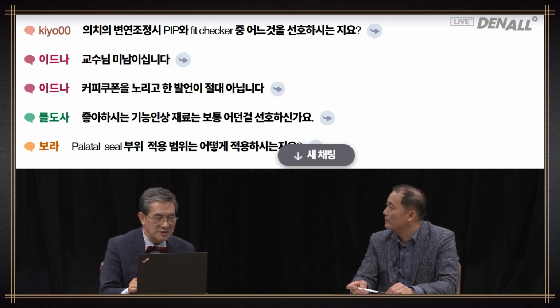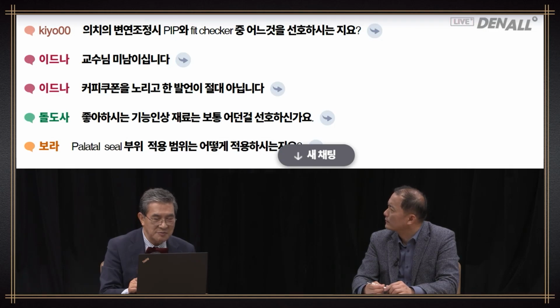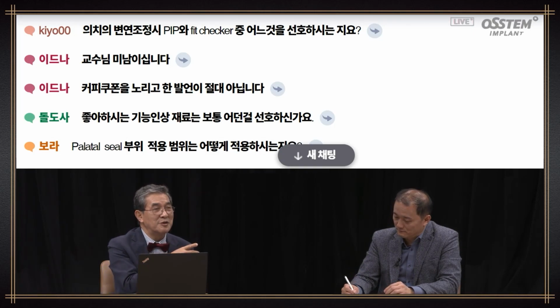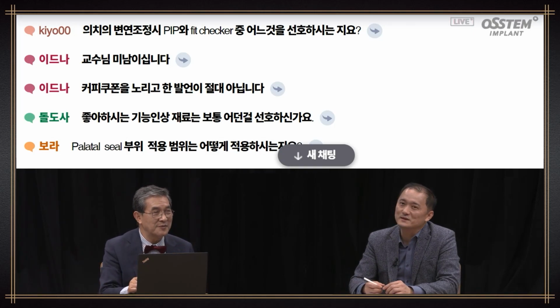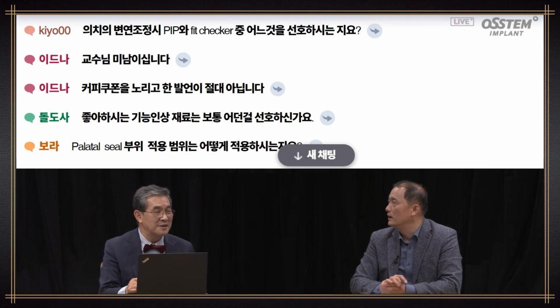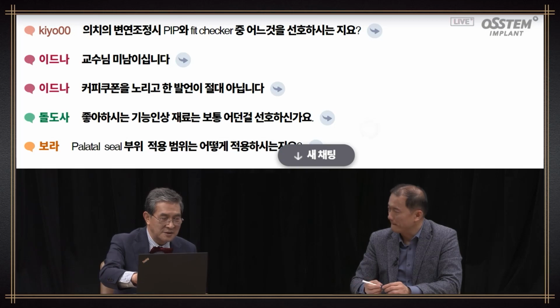And then the next question is, when you adjust the margin of the border of the denture, between PIP and fit checker, which do you prefer? I don't think we have seen much of the PIP today. Yes, I do use PIP, but personally I like fit checker because you can see everything at once, the fitness and the margins, and you can even check the polished surface area also. So I prefer fit checker.